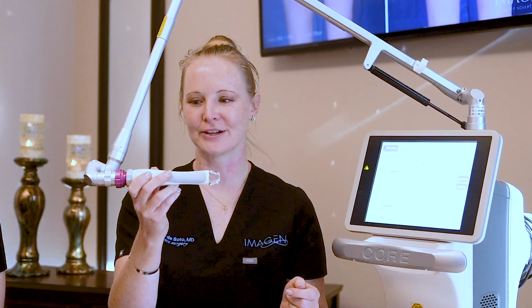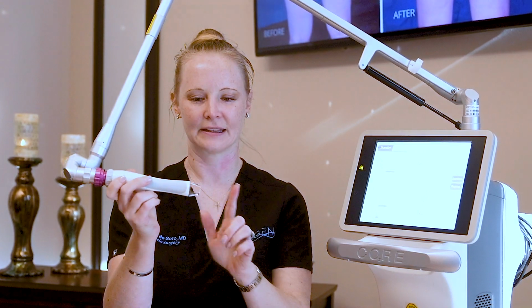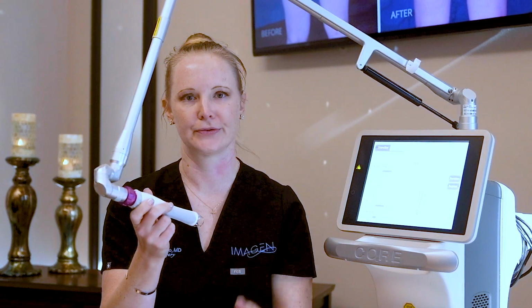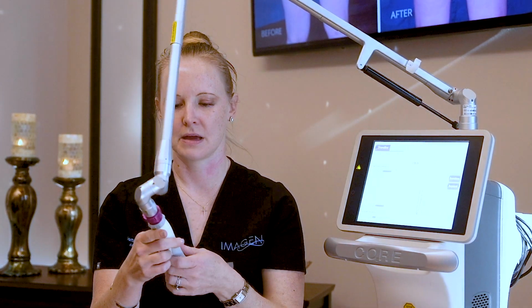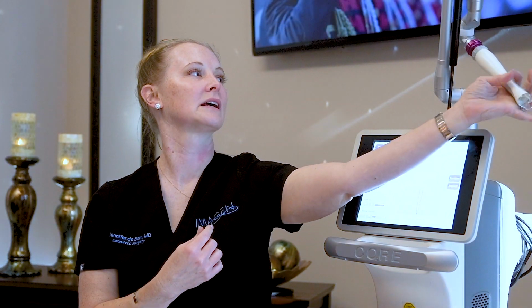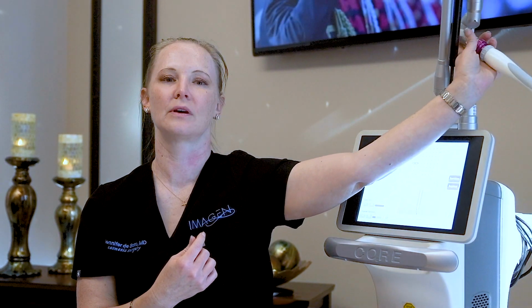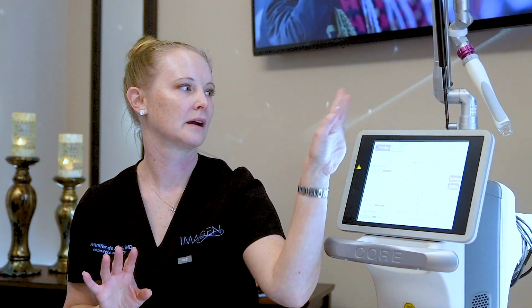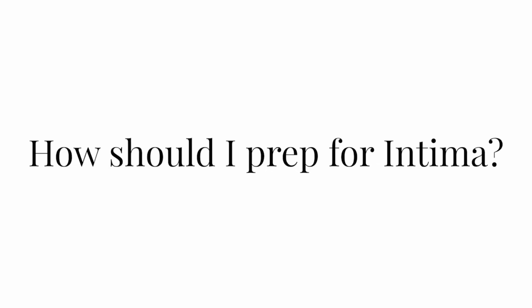Okay, so then the outer handpiece looks like this, and the laser just comes out the end here, and it's basically just a stamp treatment, just like what you would do if you were doing your face. It helps to stimulate collagen production and resurface it. It can also help with pigment issues if you have dark spots from shaving or waxing, or sometimes get some dark pigment in there. This can help clear that up.